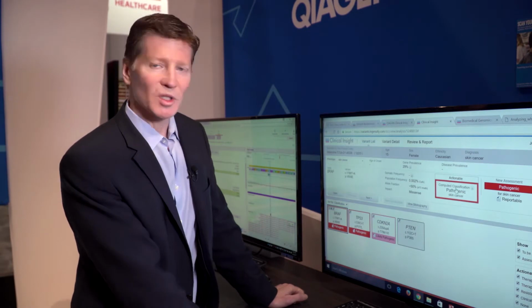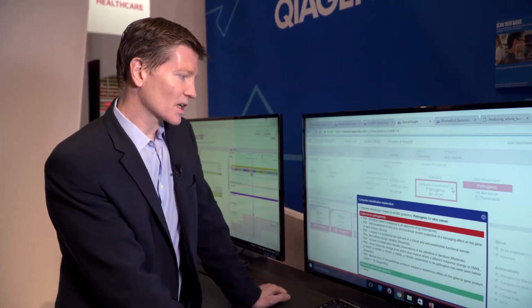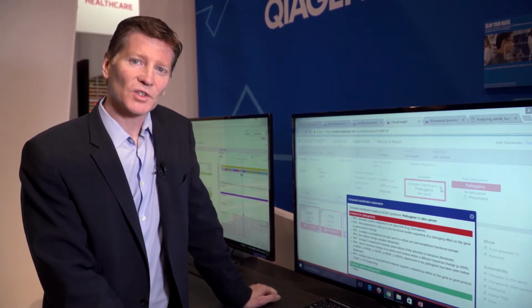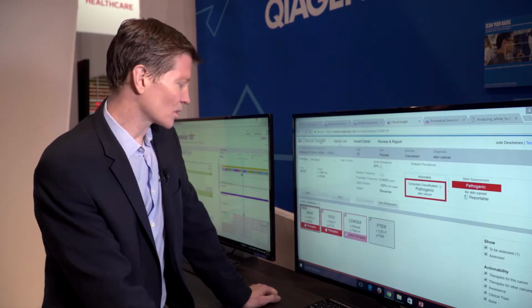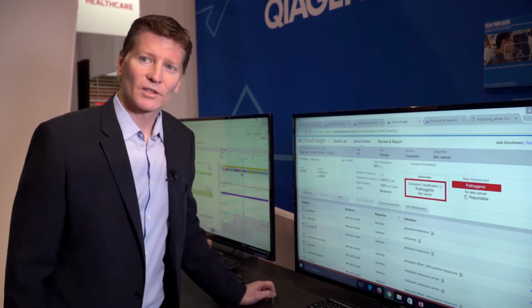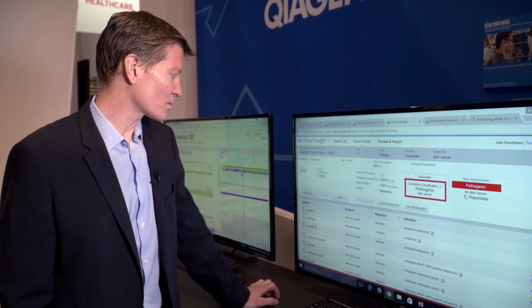It is deemed to be pathogenic. Particular lab variant scientists will review the rules upon which that classification of the detected variant was determined, and then they'll do a more thorough genetic assessment of the particular pathogenic mutation within the Clinical Insight platform.